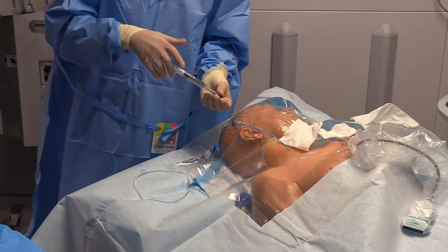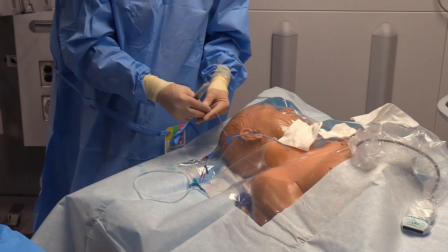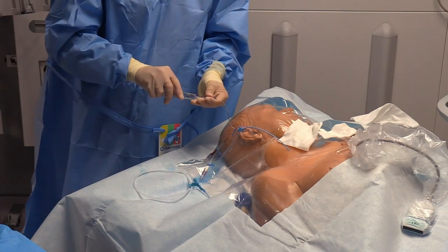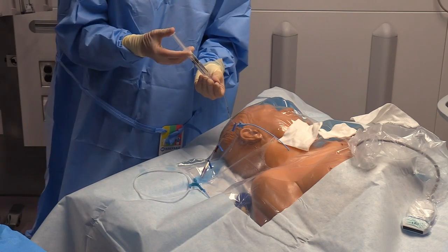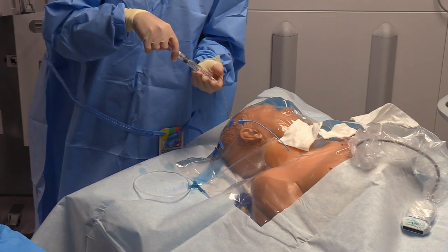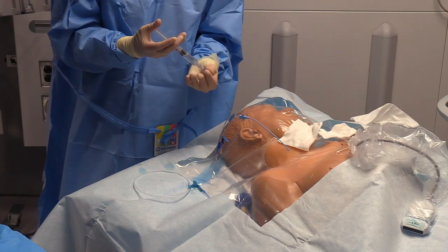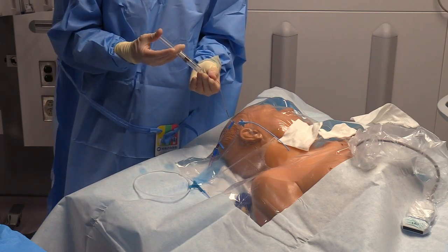You're going to aspirate first, and then go ahead and flush the catheter through, and you're going to repeat that on the blue port. First, aspirate slightly, then flush through. Aspirate slightly on the white port, just enough to see blood come. You don't have to fill an entire container of blood. You're not sending this blood for evaluation or anything. You just want to see that the catheter is patent, and then flush.